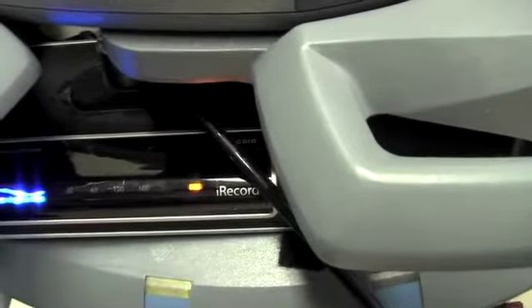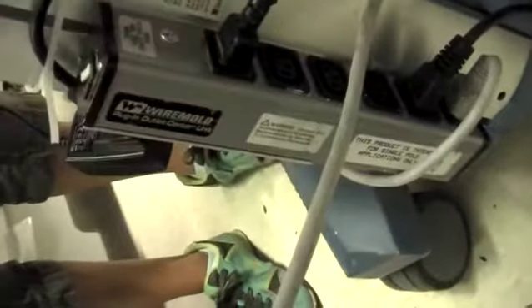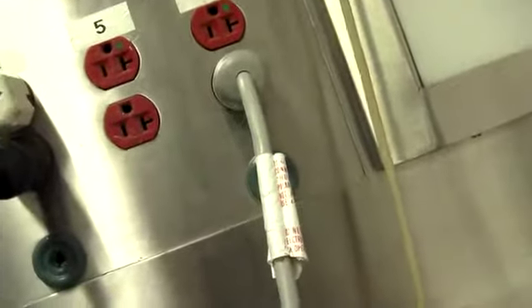So, moving along to troubleshooting some of the wiring in the back of the machine. This is your main power strip. It attaches to this gray cable here, which is now wrapped around the machine, but this needs to plug into the wall, both for the machine to be charged and for the iRecord to have power. So that's the first place I look.